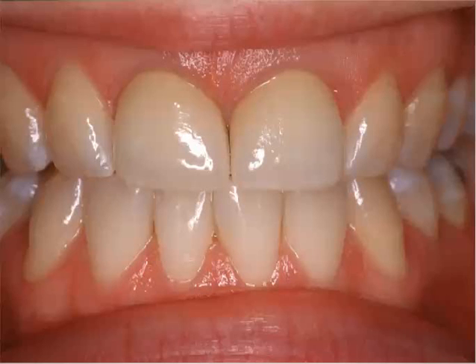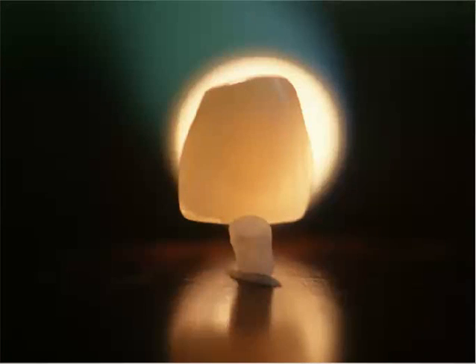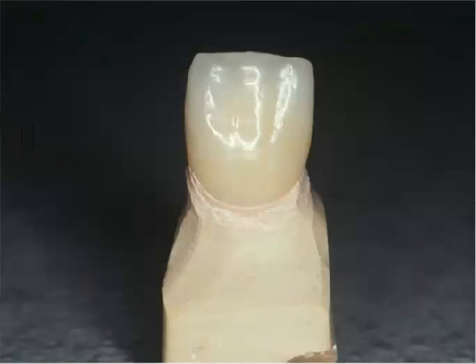In this case, a couple years ago, I decided to replace these with all ceramic crowns. So as we undertake this project, we have certain things we want to keep in mind. One is the fact that when we do replace these with our all ceramic crowns, we have the capability of illuminating the soft tissue to blend in with the natural dentition, through reflection and refraction of that ceramic product in the oral environment, and how it has a tendency to mimic the surrounding dentition and give us something which is really going to blend in inconspicuously with the surrounding teeth.